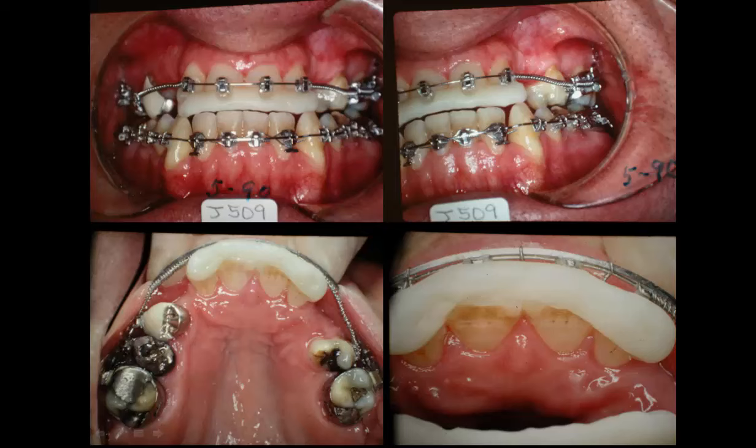Now let's take a look at the bonded block. You see, we just put this on these upper front teeth, and he bit down on it. It had a little track right in there, and that's where he chewed for about 3.5 months. So you want to make that good. It stays on the teeth though quite well.